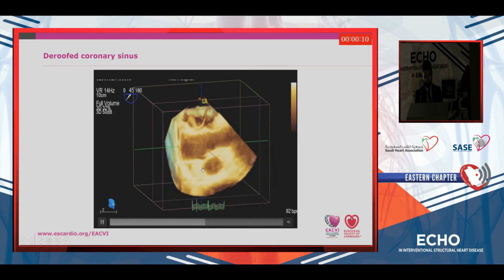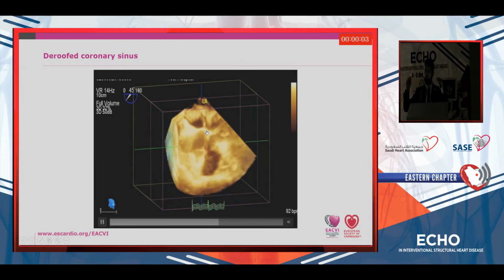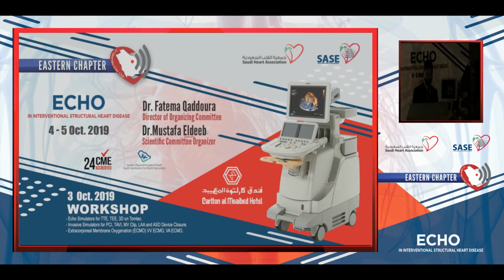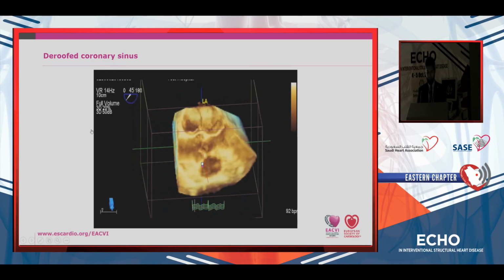Okay, and then I will come closer. This is the defect. It's like a tunnel, opening and closing with the cardiac cycle, causing this intermittent shunt. It is not a fixed shunt.